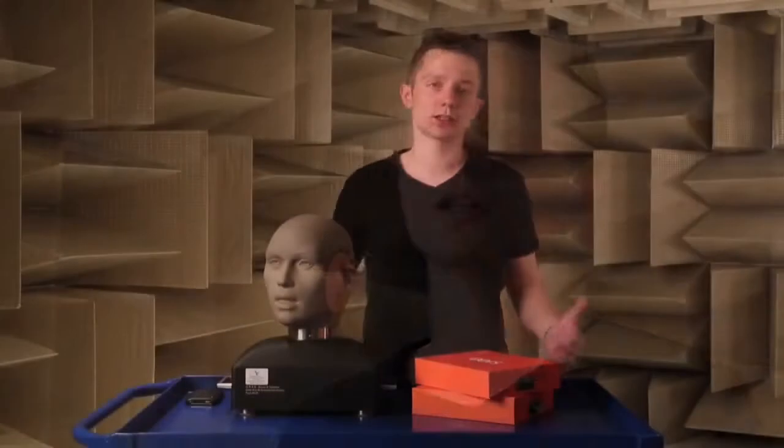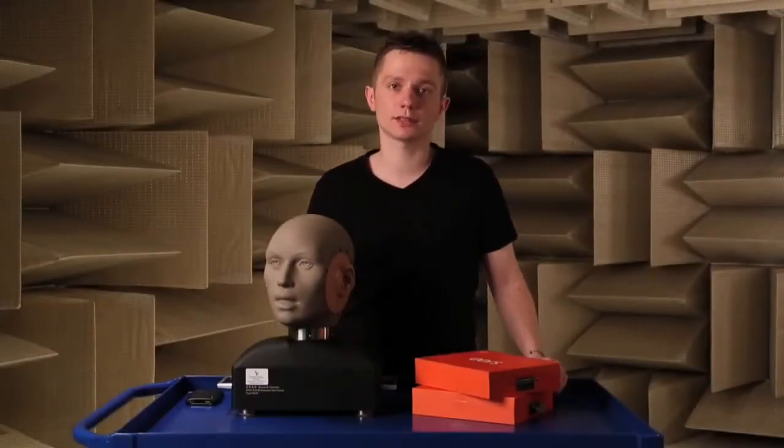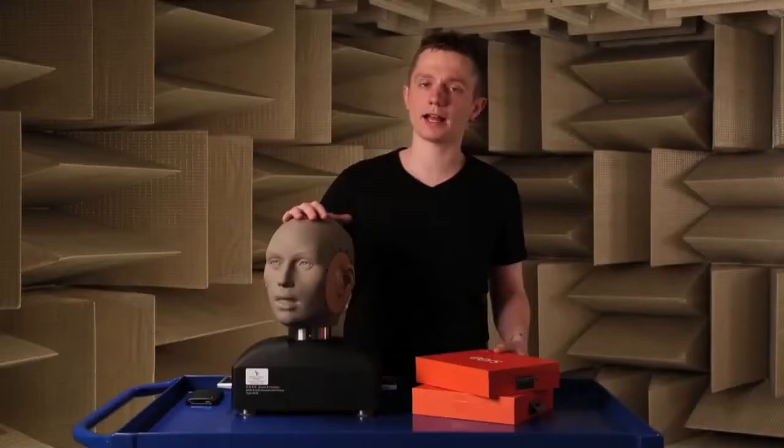Hi, my name is Kuba, Acoustic Specialist at Sonomax Technologies. We're in our semi-anechoic chamber where we normally perform all our acoustic measurements, and I'm going to show you how easy it is to fit your ears today using our HATS mannequin.